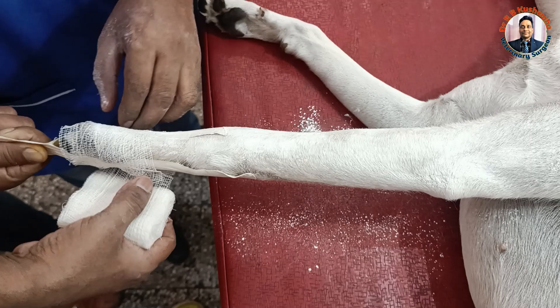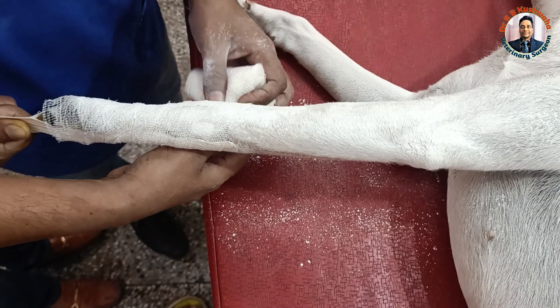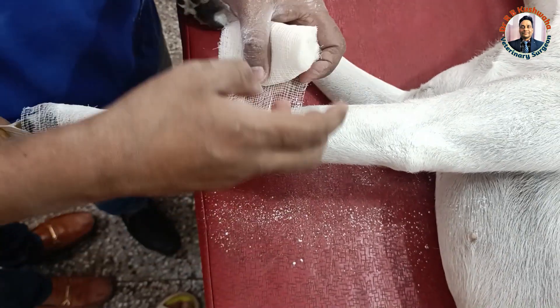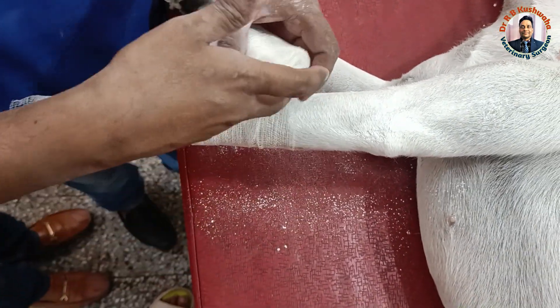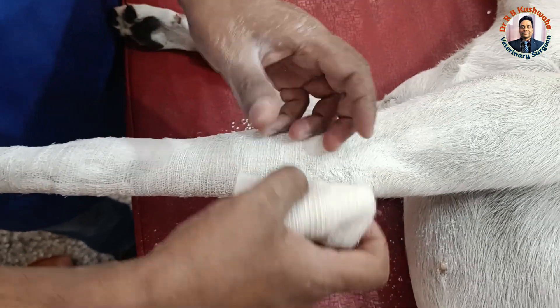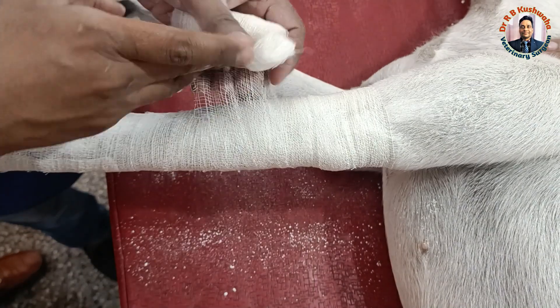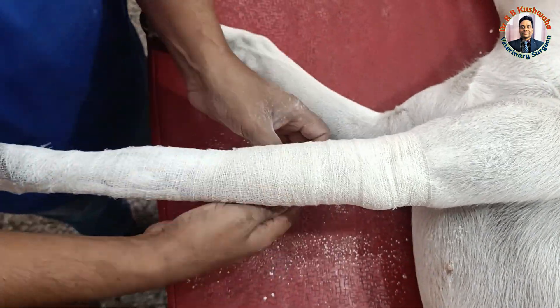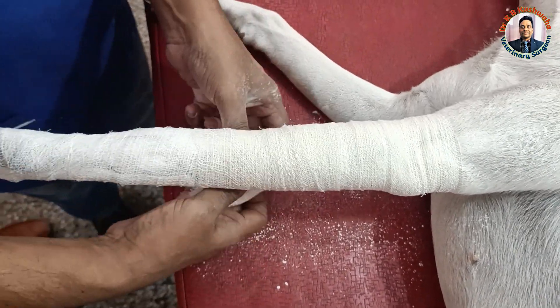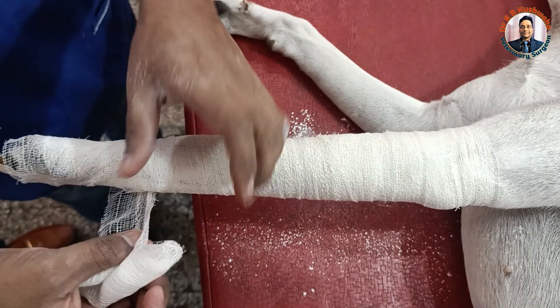Then we start the bandaging from the distal end, following the rule of 50 — that is, every proceeding roll covers 50 percent of the previous roll. This is the elbow joint. We just extend above the elbow joint, as the principle is to immobilize one joint above and one joint below the fracture.